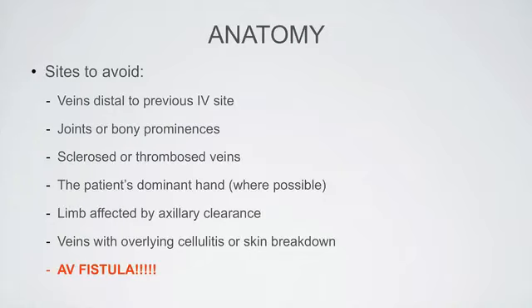And also the most important site to avoid is an arteriovenous fistula. These have been created by surgeons for dialysis patients, and if we go sticking needles into that fistula, we could inadvertently destroy or break down that fistula, and we have just destroyed the port the patient receives dialysis from, and not only will they be unhappy, the surgeon will be incredibly unhappy with you.